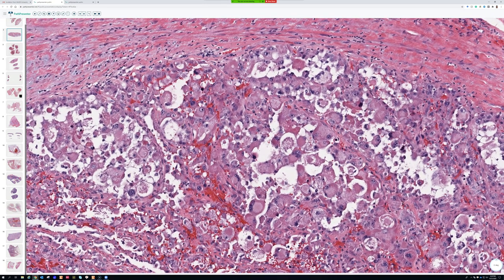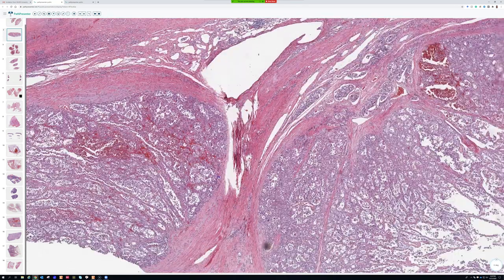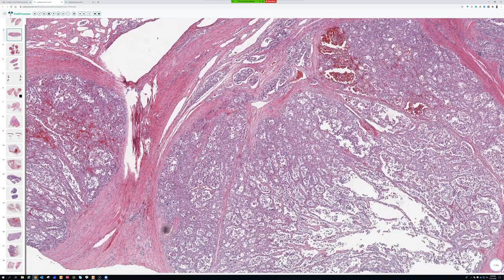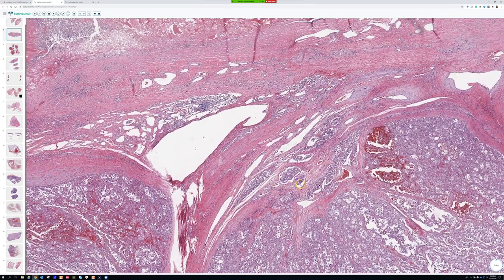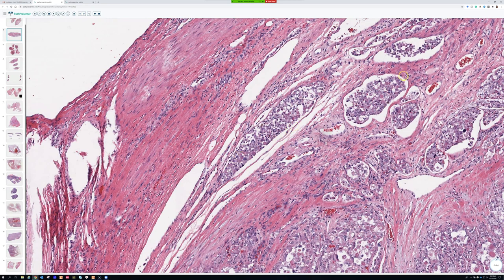Could alveolar soft part sarcoma look a little like a granular cell tumor? Yes, some cells could look a little granular, but the big difference is that granular cell tumors are usually not well circumscribed — they trickle at their edges, intercalating in an interstitial pattern between collagen bundles and splaying apart muscle fibers into a syncytial sheet. Alveolar soft part sarcoma, on the other hand, is very nicely arranged into well-circumscribed nests — that's a big difference.